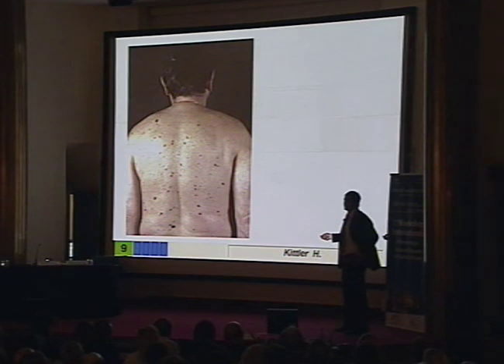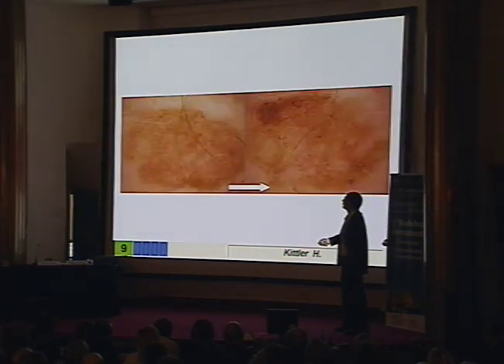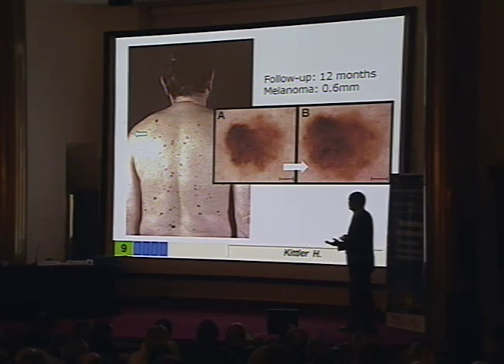Another patient, where's the ugly duck? Say stop when there is the ugly duck. Ah, I'm sorry. No, I spoiled it. Well, here's the ugly duck, but here's the melanoma. This is the change over time. So not every time the ugly duck leads you to the diagnosis of melanoma. You see eccentric hyperpigmentation, but this patient has a lot of lesions like that.